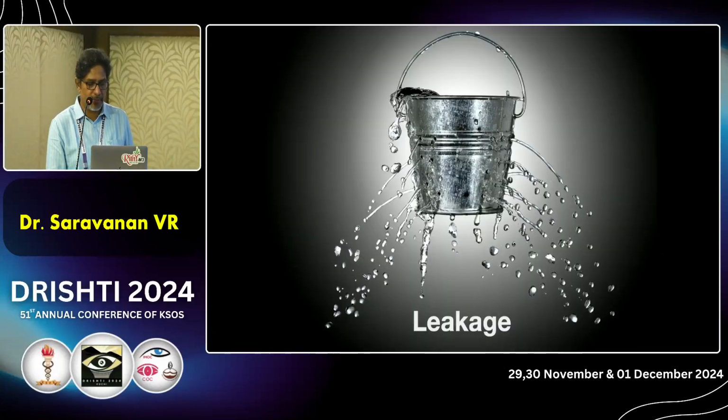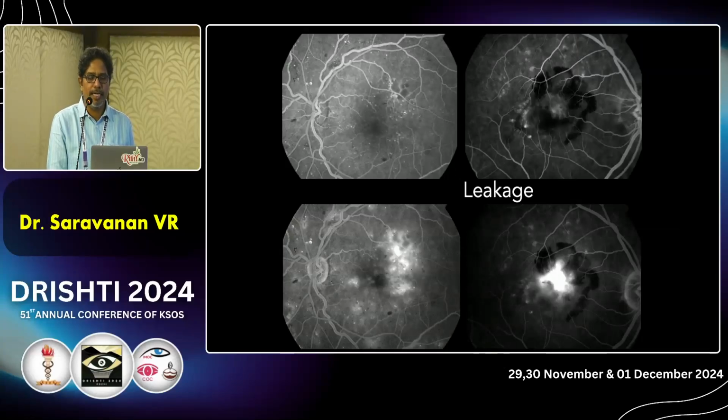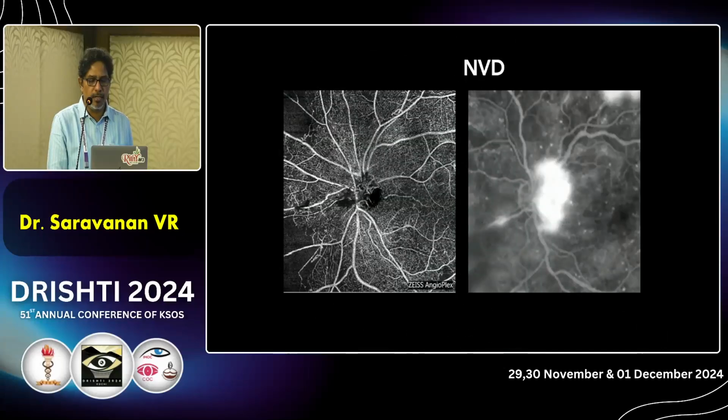One thing which is absolutely missing in optical coherence tomography angiography is the leakage. It will only show the blood vessel and it will not show the leakage. That's a very integral component of various diseases, like you see in a CNVM or diabetic macular edema. So we need to know that the dye is leaking from these places, whereas the routine OCT will not pick up these leakage patterns. So it gives a significant edge to fluorescent angiography over the new OCT angiography.